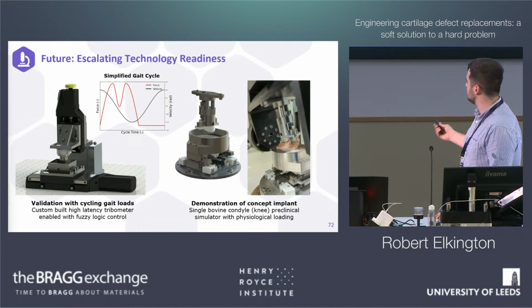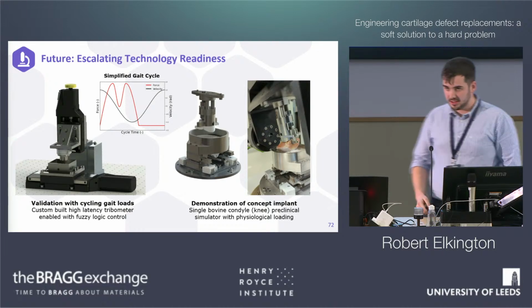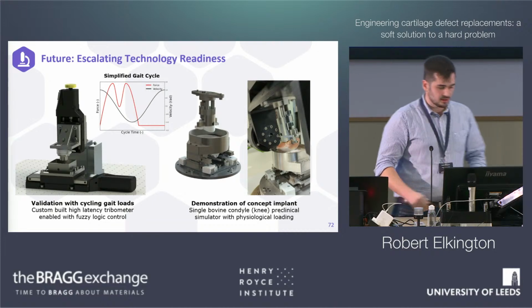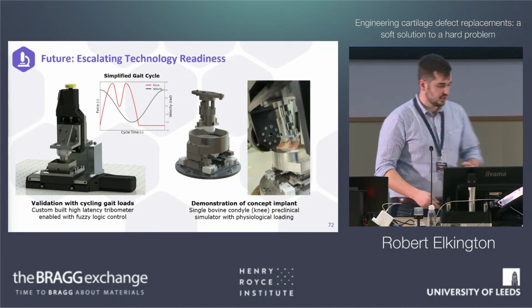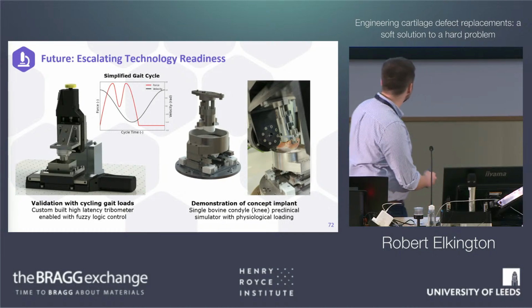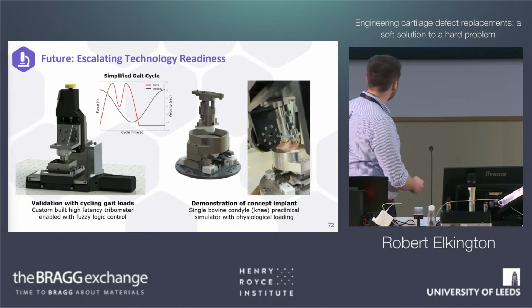When you're walking, load isn't constant. Load goes up, down, as you have heel strike. And then on the other side of that, we're going to develop some concept implants. We're going to take a knee and actually articulate it. So this is a setup that I developed last year with a very good master's group, to retrofit onto one of the joint simulators available in engineering. And that's a bit of a work in progress.